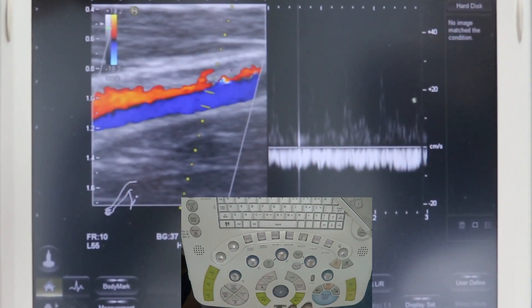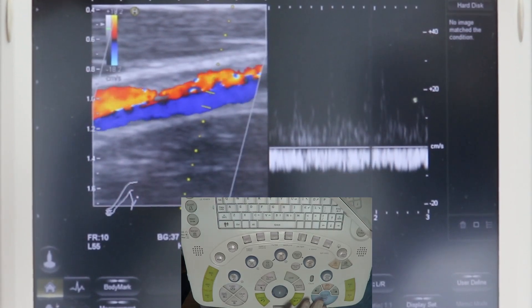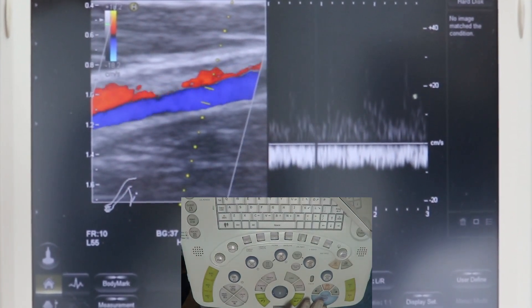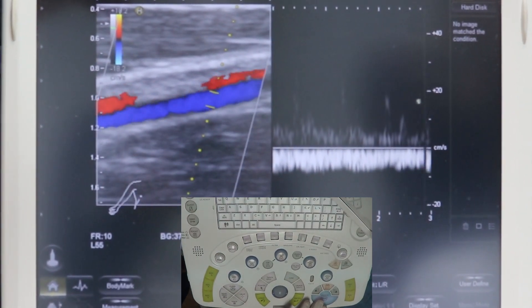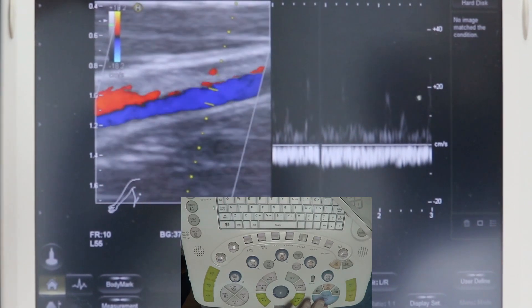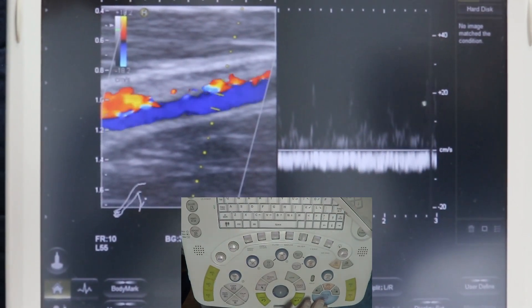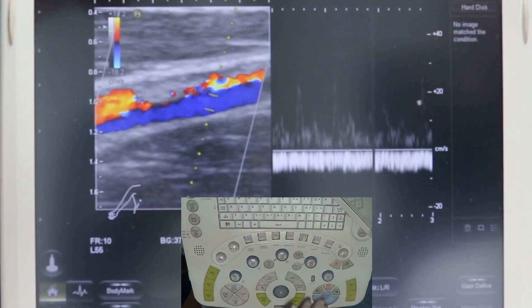By this way, you should adjust the sample volume along the whole lumen of the vein.